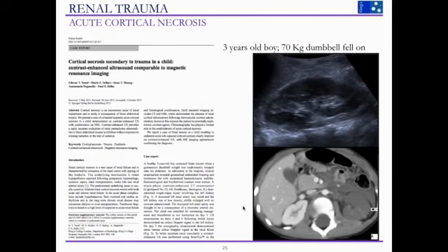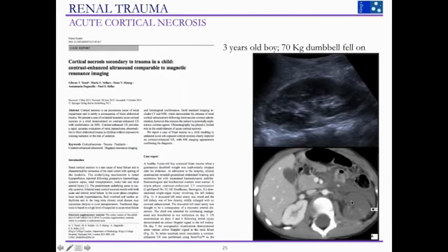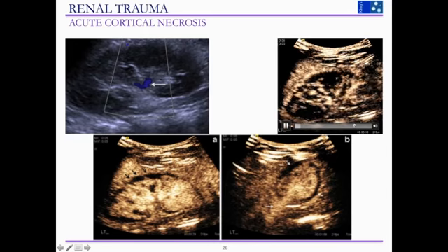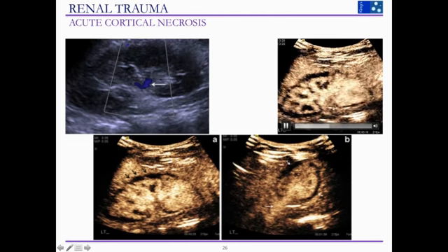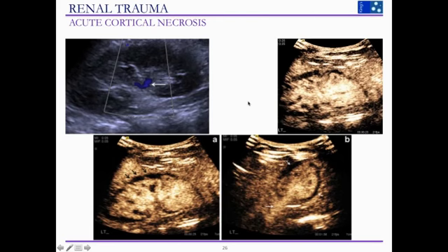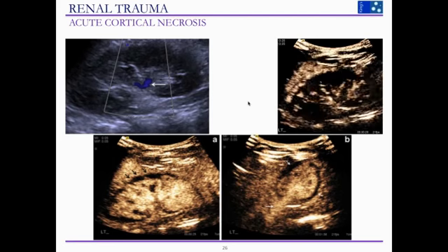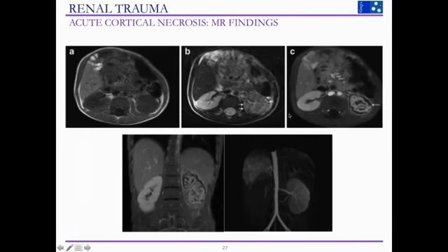A three-year-old boy was playing in his father's gym when a heavy dumbbell fell on his abdomen. He came in with acute abdominal pain. An initial ultrasound wasn't helpful and a CT scan suggested the kidney was completely devascularized following truncation of the left renal artery. When we did a CEUS, just a few seconds after contrast administration, we could see this patient had acute cortical necrosis with a complete lack of enhancement of the renal cortex. An MRI scan was also performed, and the images correlate perfectly with the CEUS findings — showing there was really no need for the MRI.